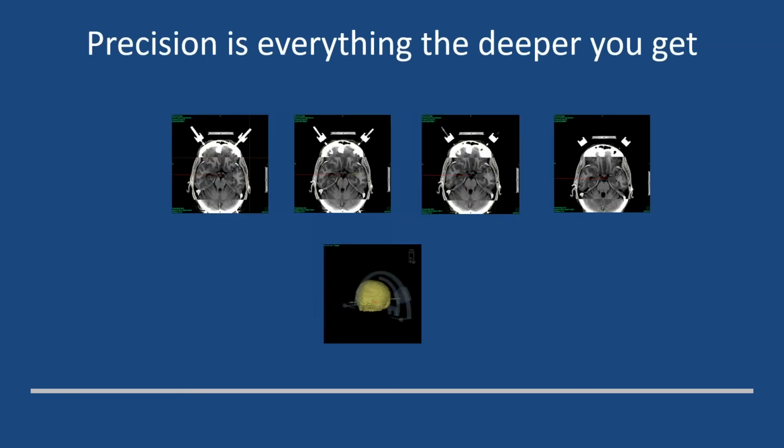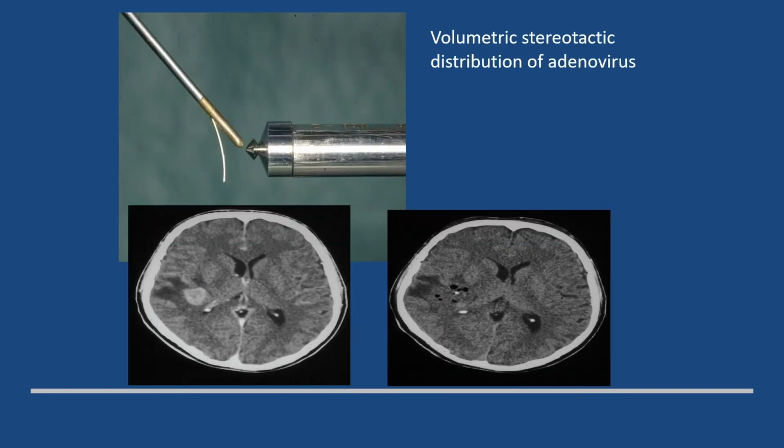So we also use this for catheter implantations, and we just published this 2 weeks ago. This is a series of CT scan fused to the MRI scan where we actually treat trapped temporal horns by fenestrating them with a Rickham catheter and additional perforations into the prepontine cistern, which allows you then very nicely to prove that you are where you want to be. This is maybe a more esoteric application, but a very nice one which shows the beauty of the intraop image during a procedure to show where you actually were and whether you achieved your goal.